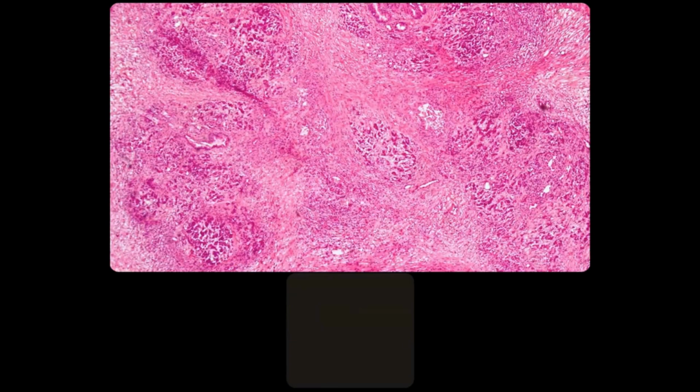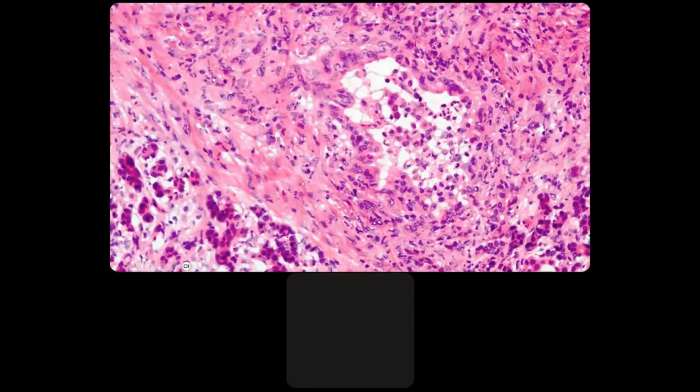Okay, here's another frozen section, actually a very good frozen section. Again, highlighting atrophy, chronic inflammation, but again, you'll see surviving ducts that look a little angry at this magnification. But look, it's respecting the stroma, it's respecting its relationship to acini, non-infiltrative, despite the nuclear hyperchromasia. It's well formed. It's a little distorted, but still it's well formed. Chronic pancreatitis.